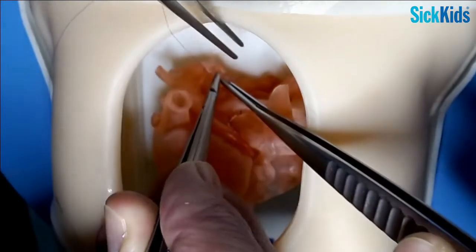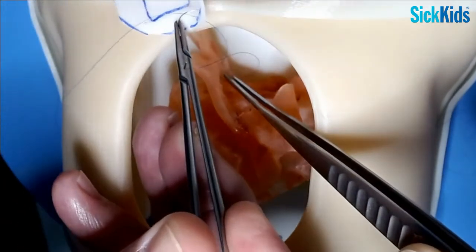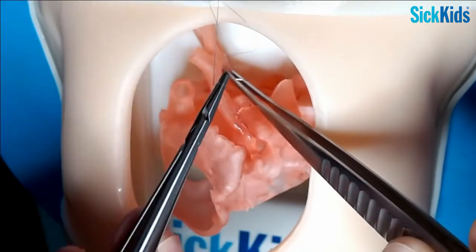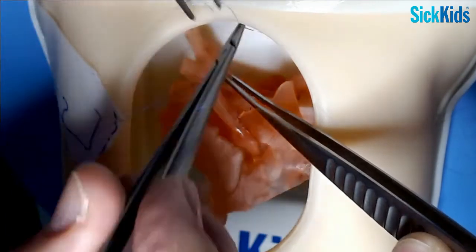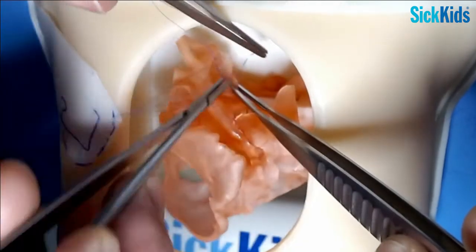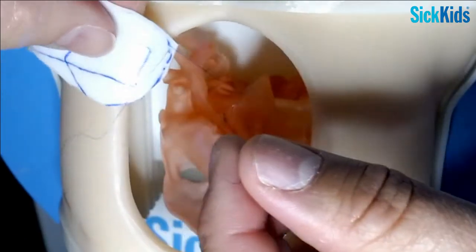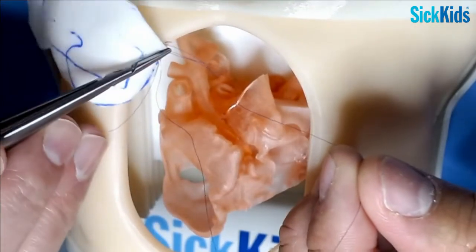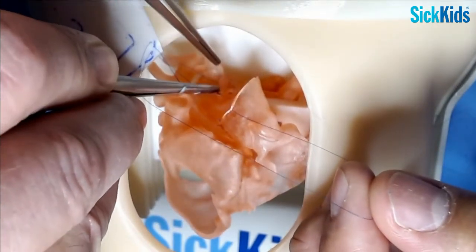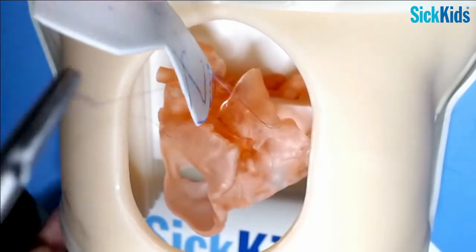Perfect. Okay, so let's take that patch down inside now.